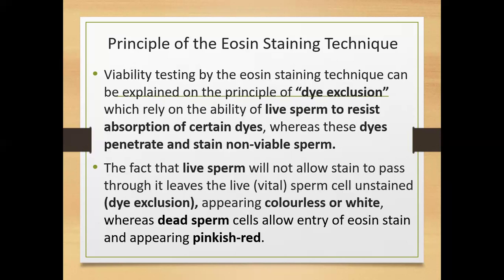In this case, what will be the color of the sperm which is actually not dead? Pink. Colorless. Colorless, Rhoda, great.